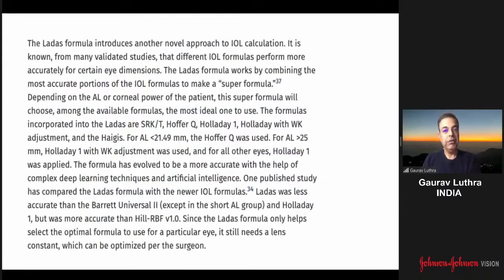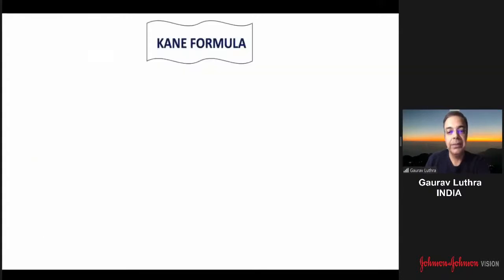It's a novel approach because it uses different formulas and then tries to see and improve upon them to give a personalized measurement for you, a personalized constant. In that way you can derive from the benefit of other users around the world, where you can grow onto your own formula and come out with a better result.